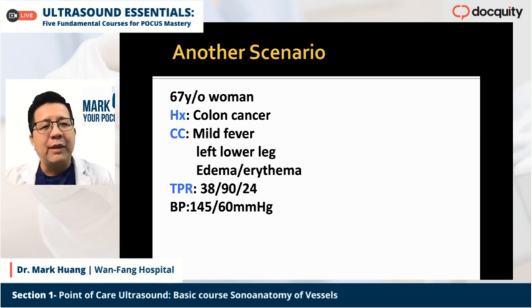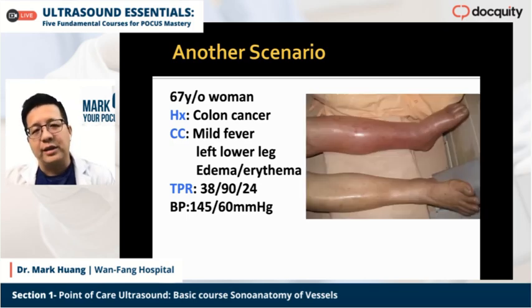Left lower leg edema, but this patient with colon cancer, that is her vital sign. So you can see this. These pictures show her legs.